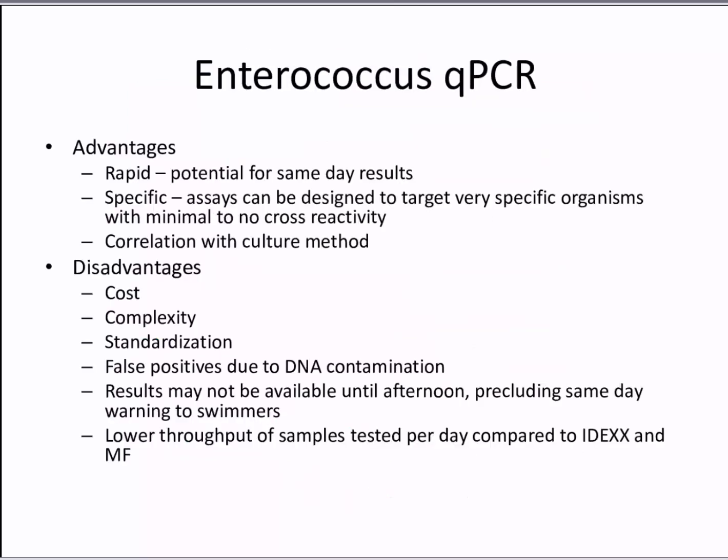So Enterococcus qPCR, the good, our advantages: rapid, so there is a potential for same-day results, but trying to get results by noon, which is the target, is doable, but you have to have the right conditions to be able to get that result out by noon.